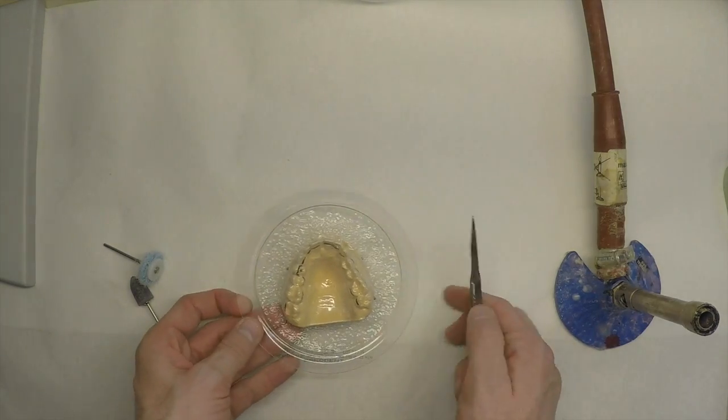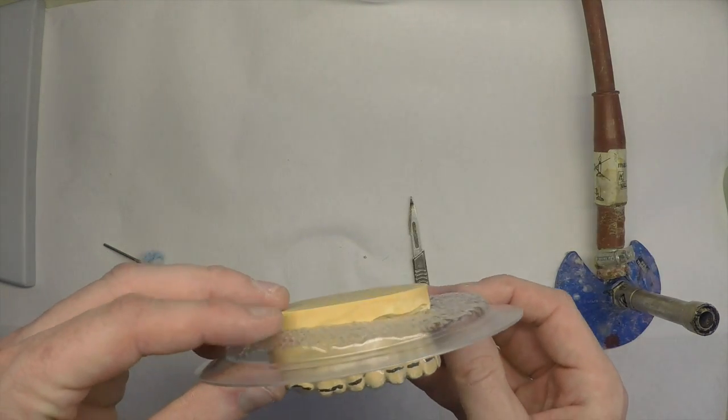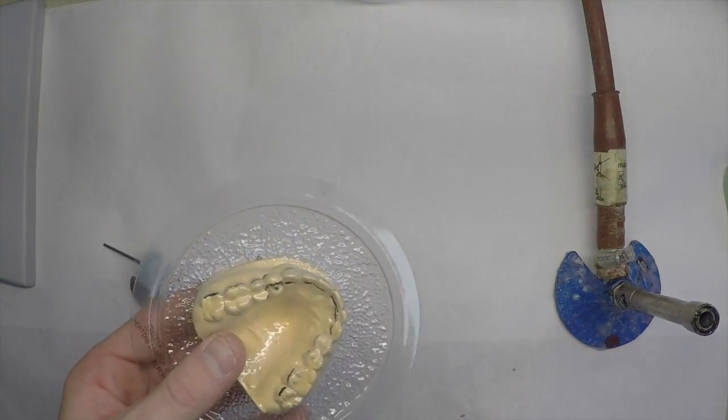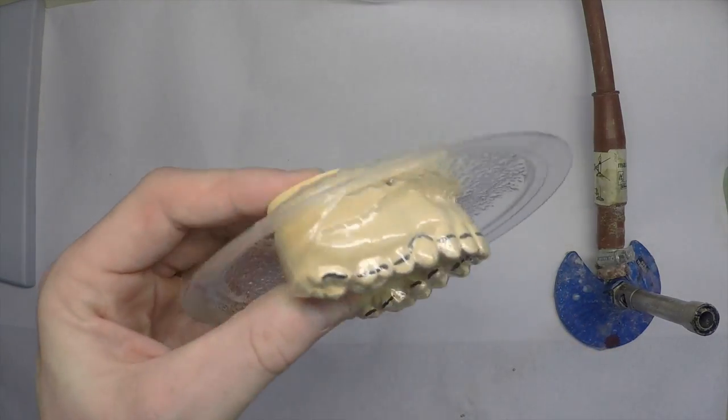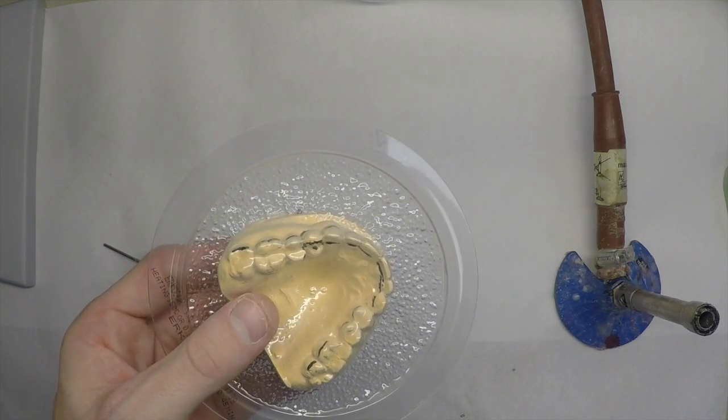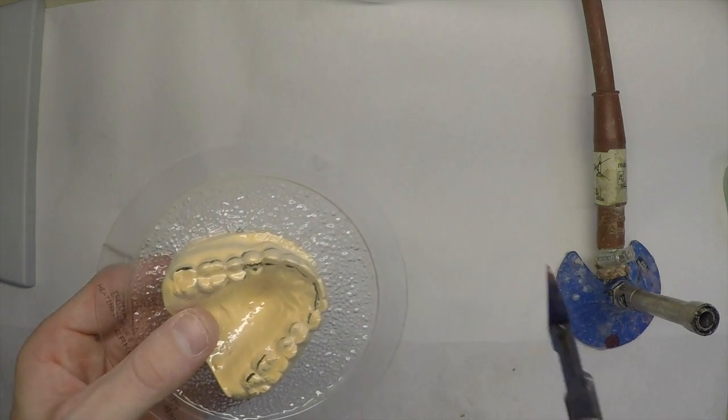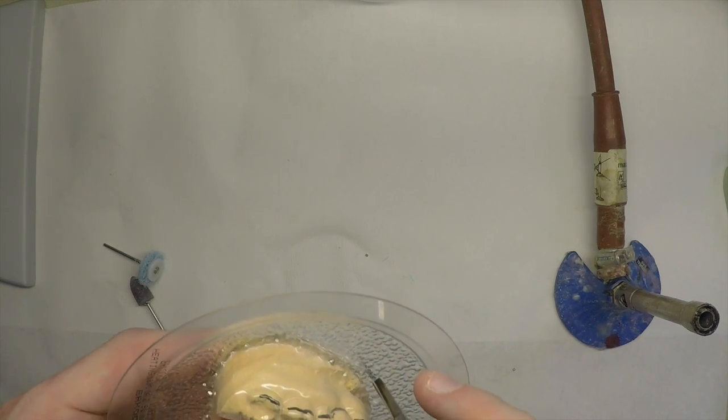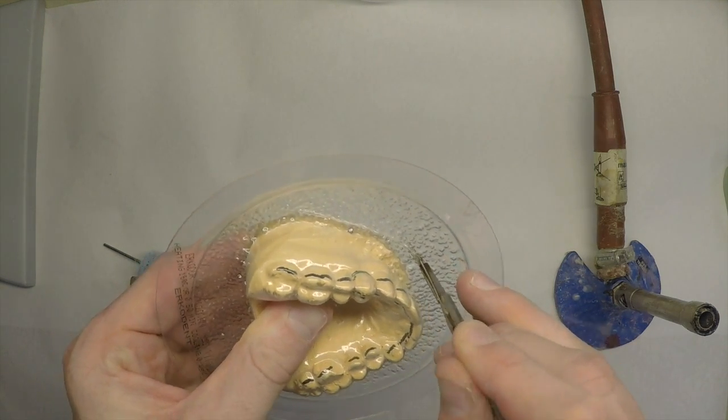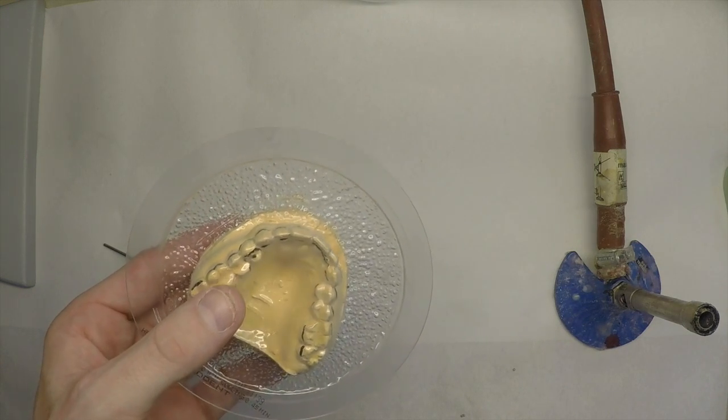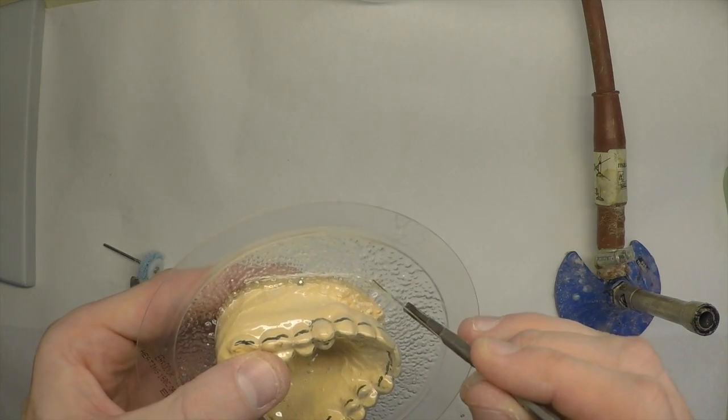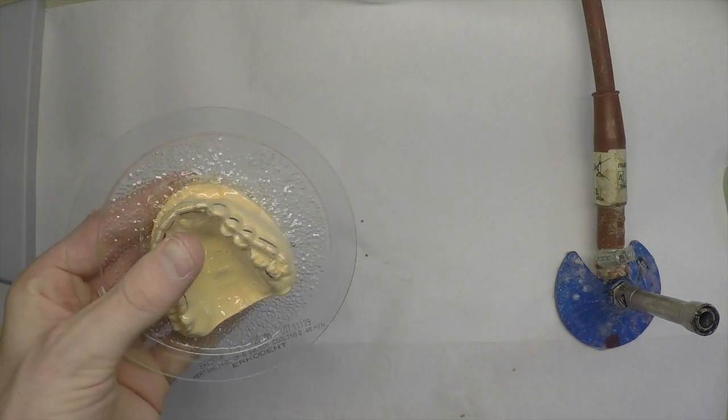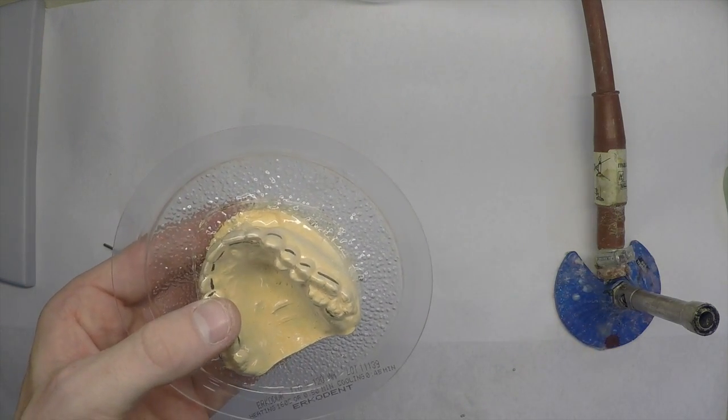Once we have our vacuum form pull down made, one millimetre, we want to just get rid of the excess. And we do this by heating a number 11 scalpel with a flame to remove the excess.